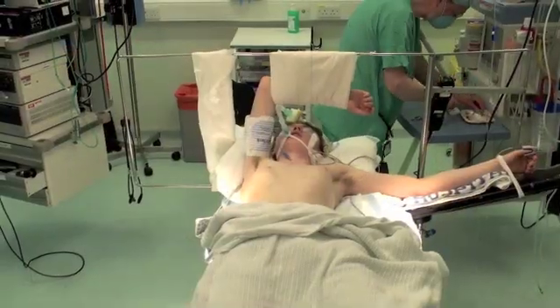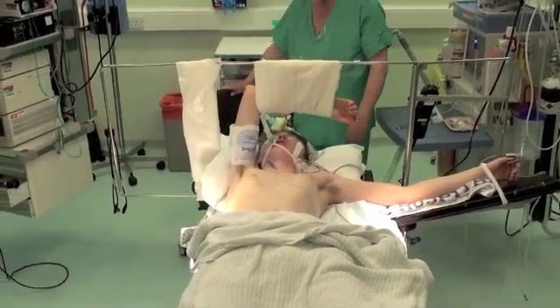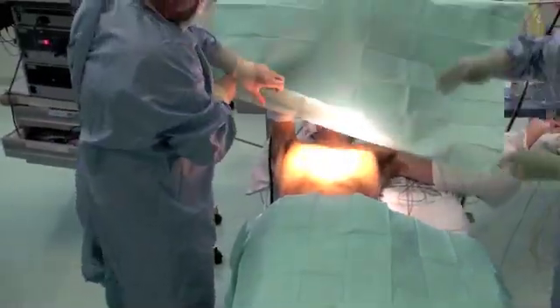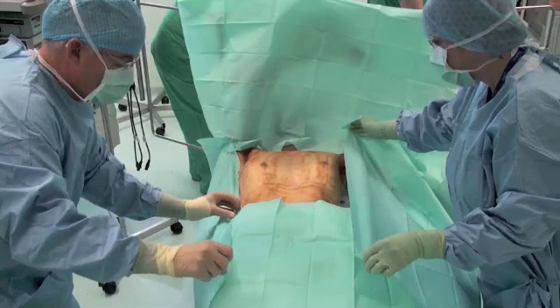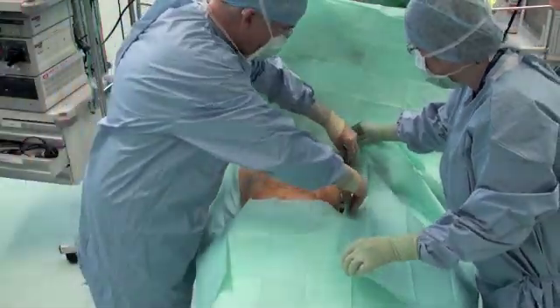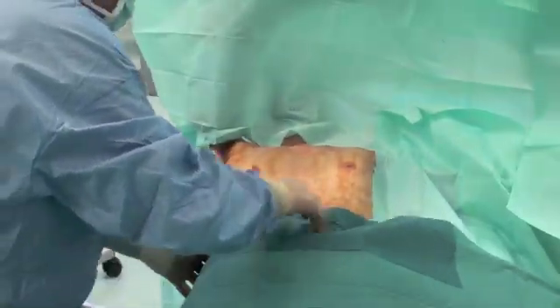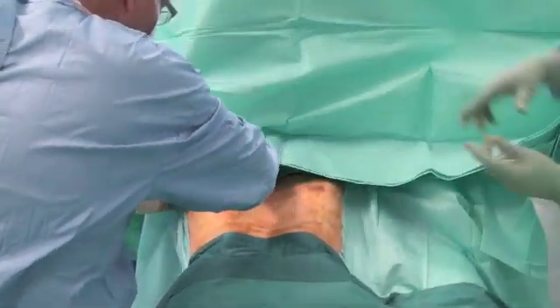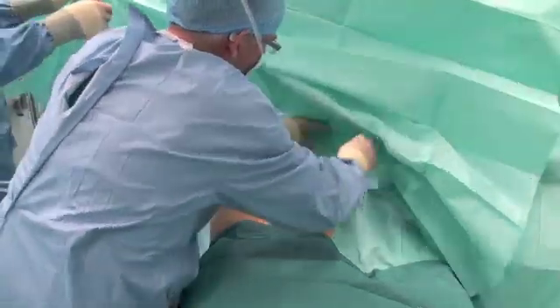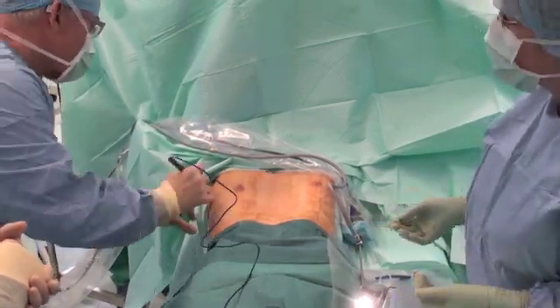Hello and welcome to this video on the Nuss procedure. My name is Joel Dunning and we're here at the Royal Infirmary with Professor Hans Peeligard, a world expert on the Nuss procedure. This initial video is just showing the setup of the patient and how we drape, exposing the chest laterally either side. Mr William Walker is also present as the assistant. The Nuss procedure is designed to repair pectus excavatum, and our thanks goes out to all the patients who gave permission to appear in the video.